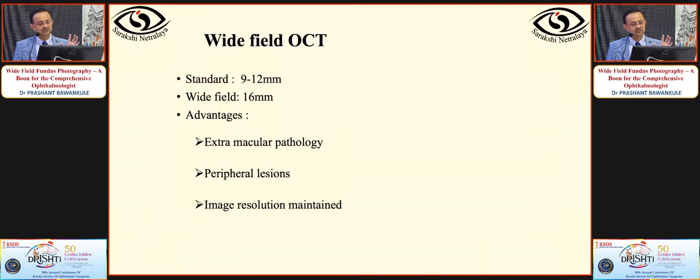On an average, on a normal fundus camera, you see a view of only 35 to 40 degrees. And if you add a 7 field, you can see up to 70 degrees, not beyond the equator. And ora to ora, the dimension is almost 220 degree. It means we are just seeing one third of the retina, and based on that, we are presuming our diagnosis. So that is the reason with this new toy, we can think something different and it can challenge the way we look at a particular disease.